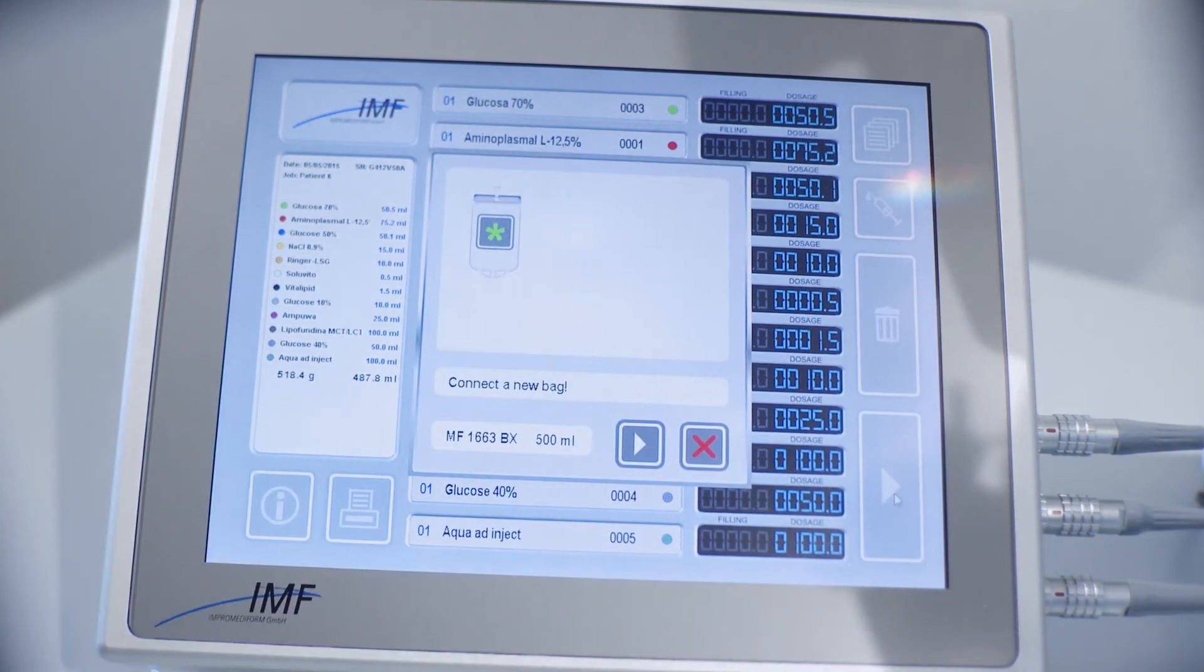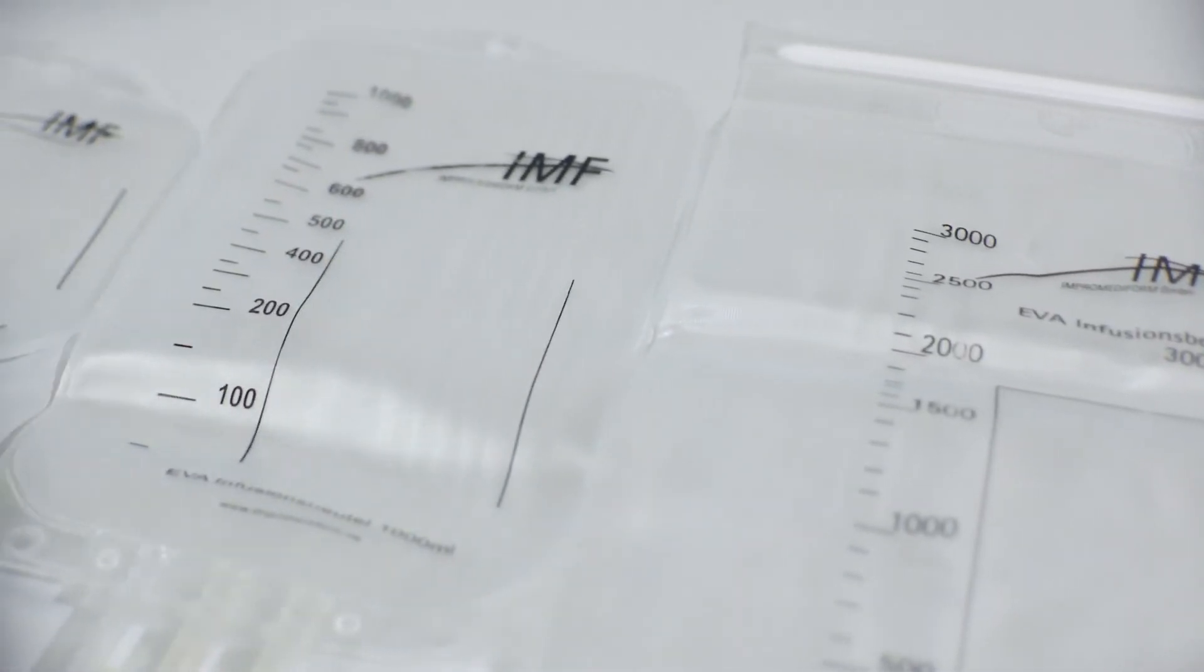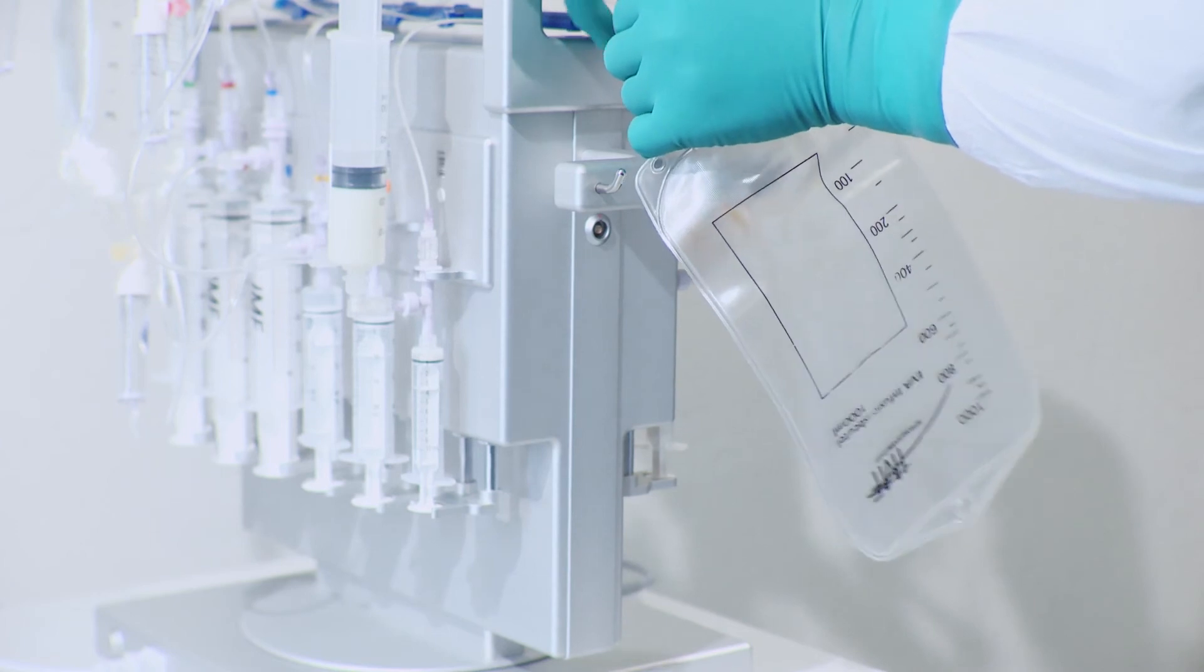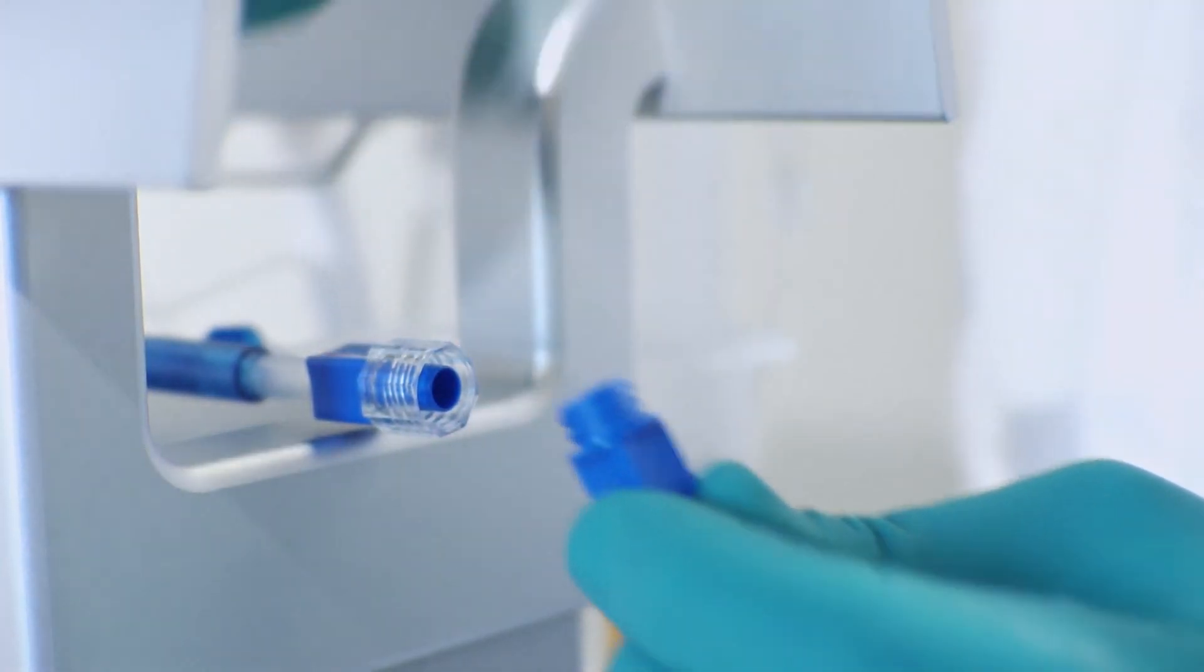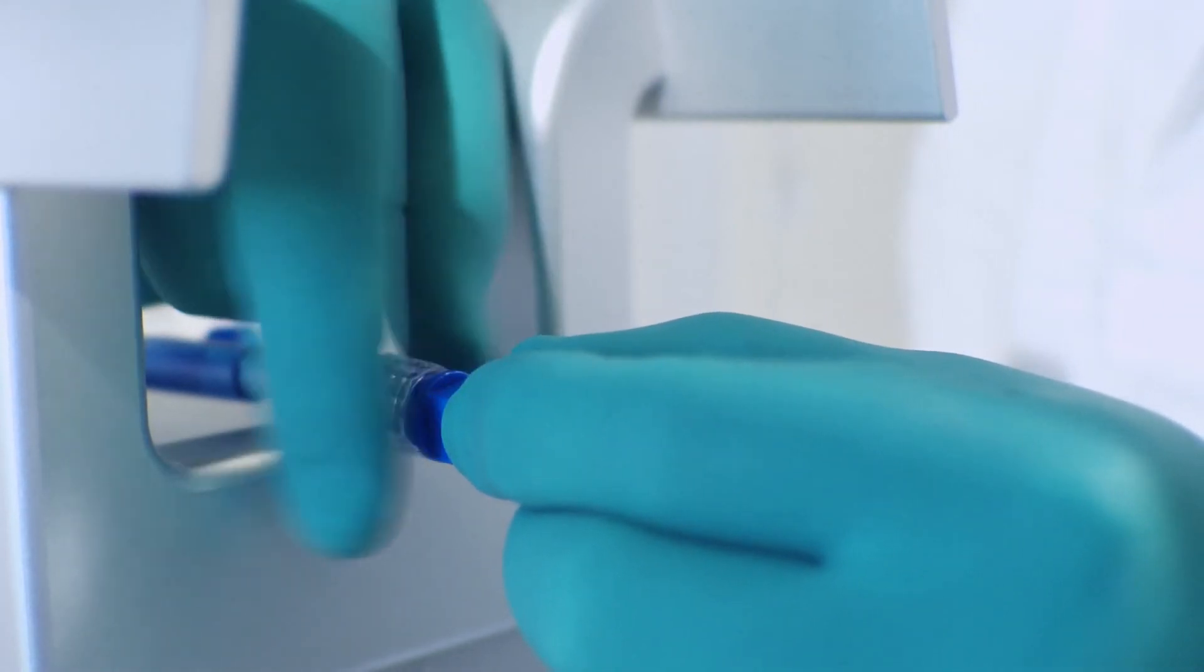Ensure the requested TPN bag is attached to the Medimix multi-compounder. Select one from our wide range of TPN bags, clear or light-protected EVA, multi-layer and dual or three-chamber EVA bags. Attach the selected bag using the special IMF rotatable nut used for facilitating closing and opening of the bag to the central line.